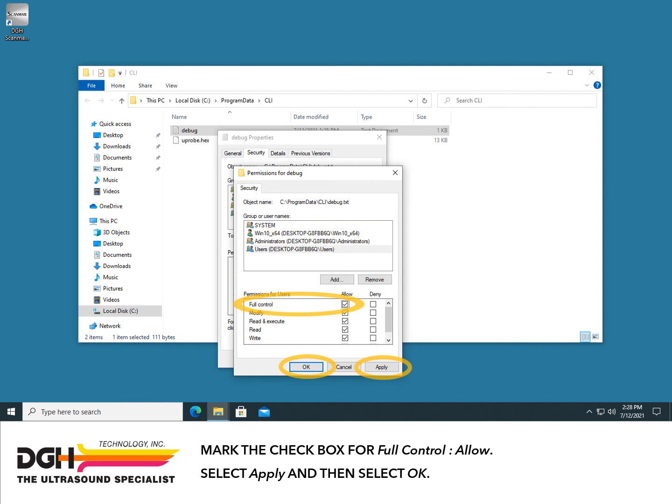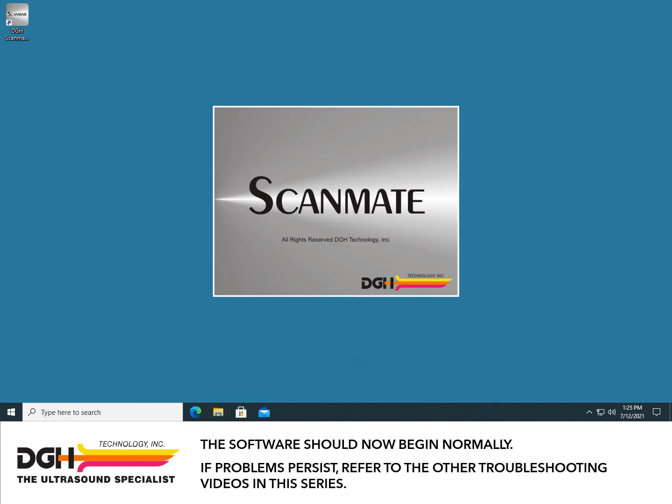Mark the checkbox for Full Control Allow. Select Apply and then select OK. The software should now begin normally. If problems persist, refer to the other troubleshooting videos in this series.